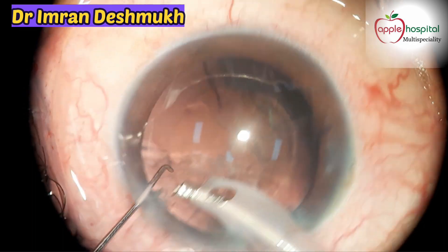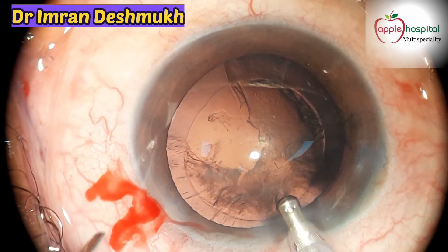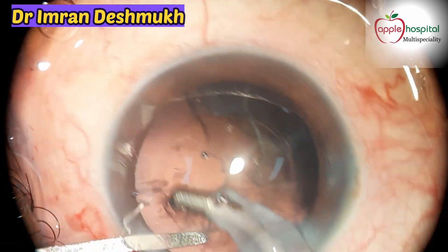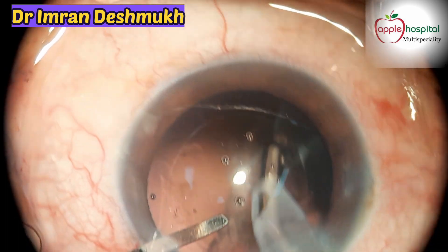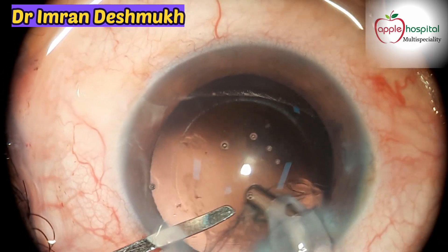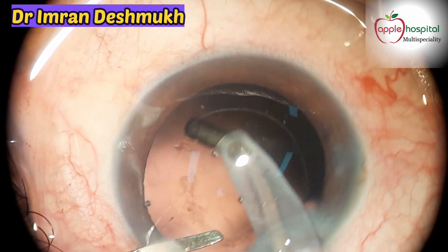I would not recommend juniors or fellows to do this — you need experienced surgeons for removing the cortex. Always use your irrigation-aspiration probe. Here we're using a coaxial I/A probe — see how easily the cortex is being removed. You need a swinging moment; the last part should be the sub-incisional cortical matter because that's the toughest part.